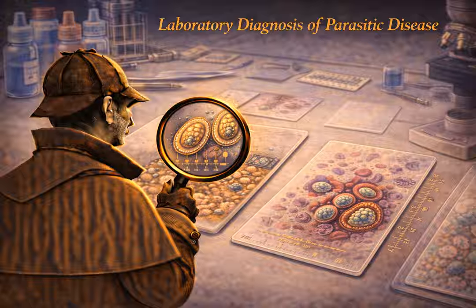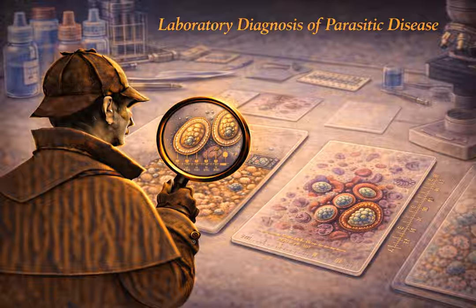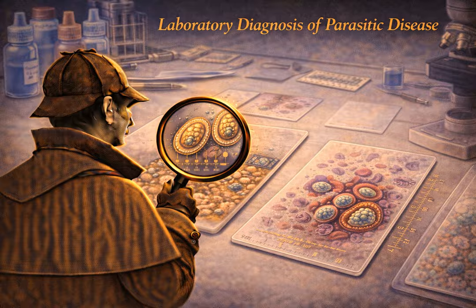If you have a patient with profound watery diarrhea, maybe an immunocompromised HIV patient or someone who just traveled and you suspect crypto, you must explicitly request a modified acid-fast stain. Acid-fast, just like we use for tuberculosis. Exactly the same chemical principle. Their oocysts have a tough, waxy outer wall. With a modified acid-fast stain, they retain the carbolfuchsin dye and stain a brilliant, bright pink or red against a counterstained blue background. If you do not explicitly check the box for acid-fast or order a specific Crypto/Cyclospora antigen panel, the lab will not do it.